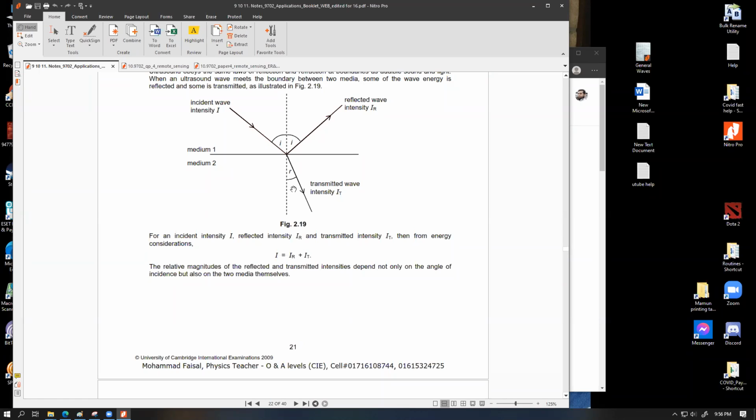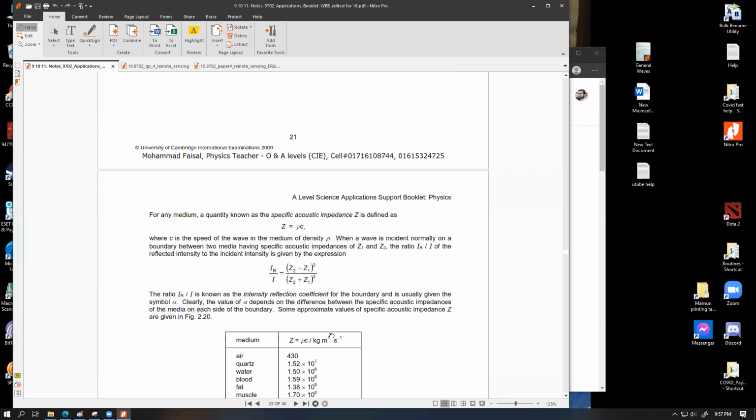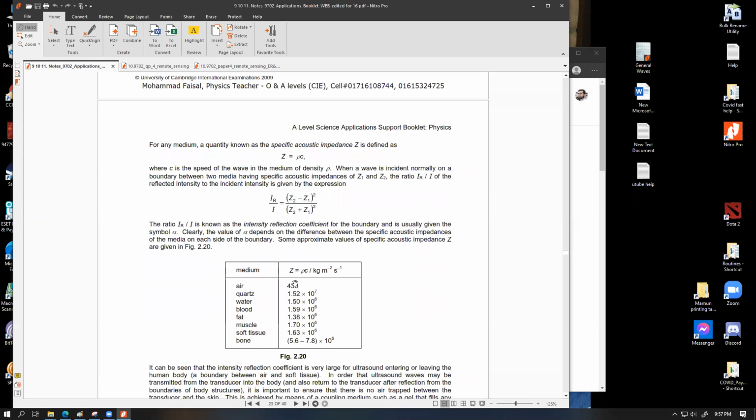couldn't we have done something to directly মানে এরকম একটা, ও আচ্ছা স্যার, এখানে কি আমরা এয়ারের সাথে কন্টাক্টটা মিনিমাইজ করার জন্য এটা করছি? Exactly, precisely, that's the aim. We don't want air to be in between, because air has a very different Z value, which makes the whole measurement skyrocket towards diminishing results.